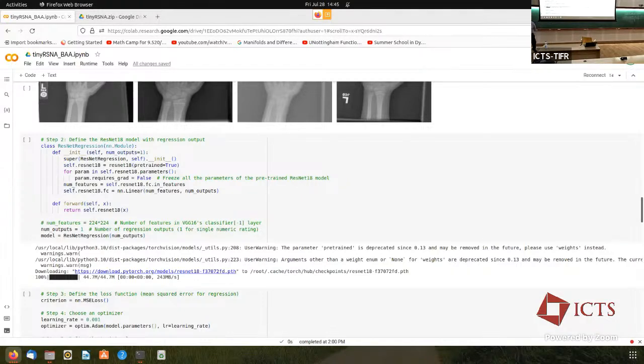There's another trick that one often uses, which is to allow everything to change. You say, oh, I don't know whether freezing everything will work or not. I will allow these weights to change like any of the other weights, but I will change the rate. I will allow these weights to change 20 times faster than all of the others, which means essentially you're allowing for the later layers. Okay, so those are some of the tricks that people use.